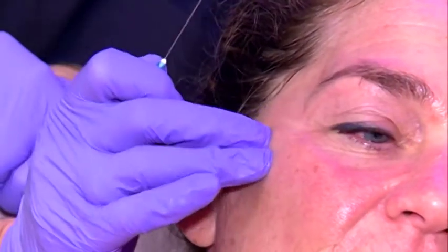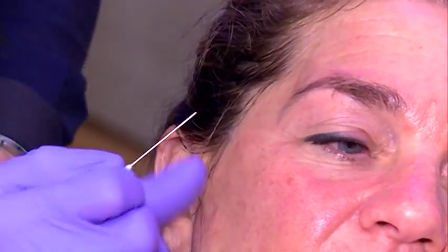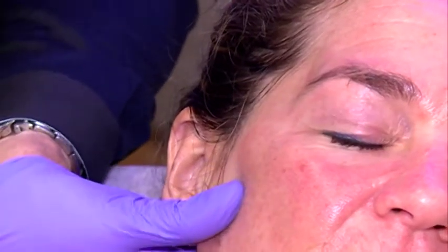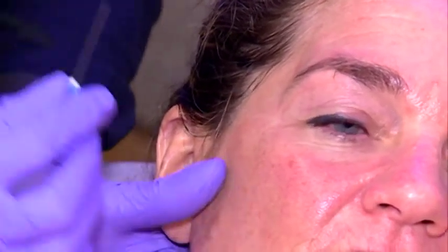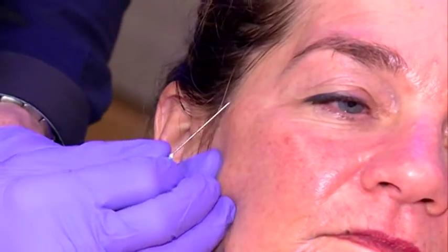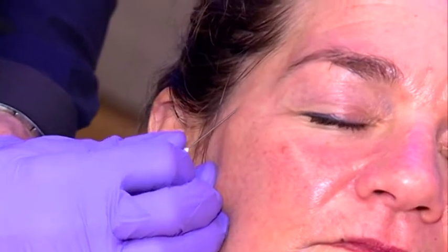So I palpate my upper zygomatic arch. I'm using now a needle for the insertion point. I stretch the skin a little bit. And my insertion entry point defines the level of injection. So if I want to go deep, I go perpendicular down, which I do not want. I'm doing it superficially, sorry.